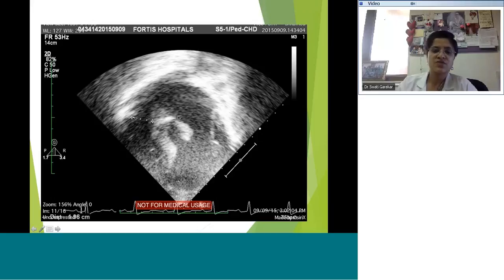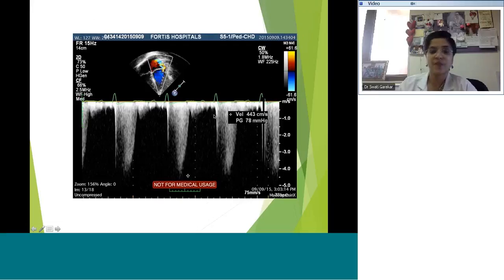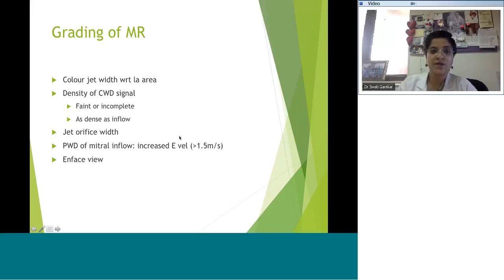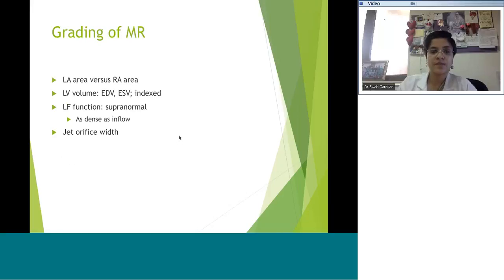The mitral valve annulus was much larger than the tricuspid, but that information alone isn't enough — you need a Z-score and need to say this is plus three and hence worthy of annular tightening. You can also look at the CW spectral Doppler interrogation of the MR jet to see how dense it is. If it's not very dense, that favors mild or moderate regurgitation.